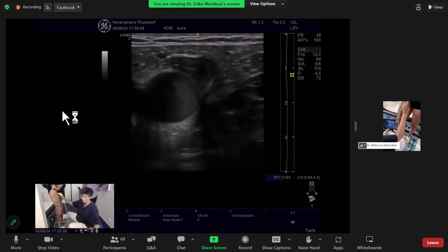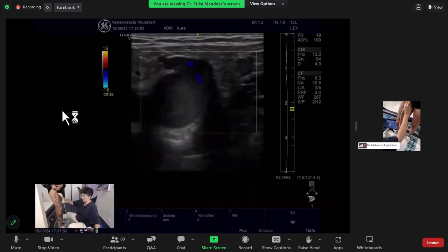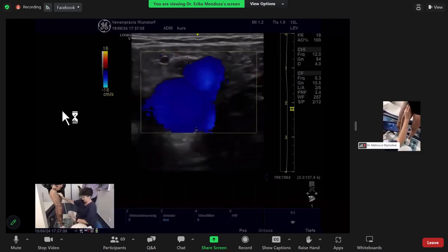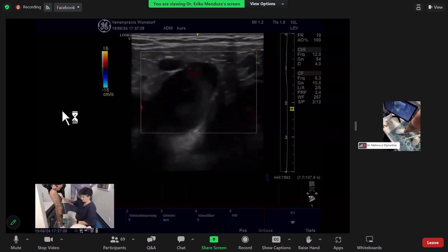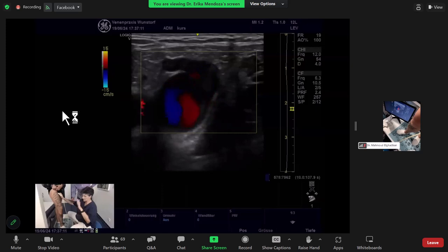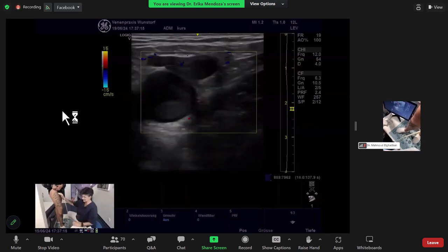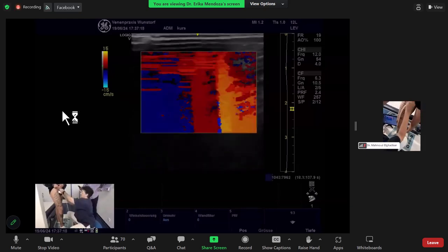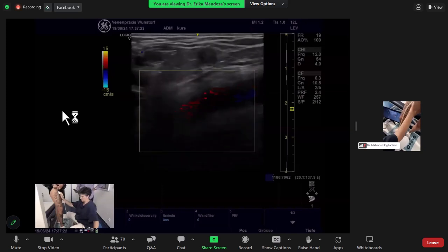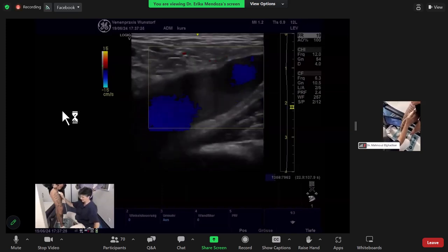Okay. Now we come to what we are here to learn today. Lift the toe once, and lower it again. She puts up the toe and lowers it. And if you see this very slowly, I make the same in longitudinal. Thank you very much. In longitudinal aspect, let us find the junction.